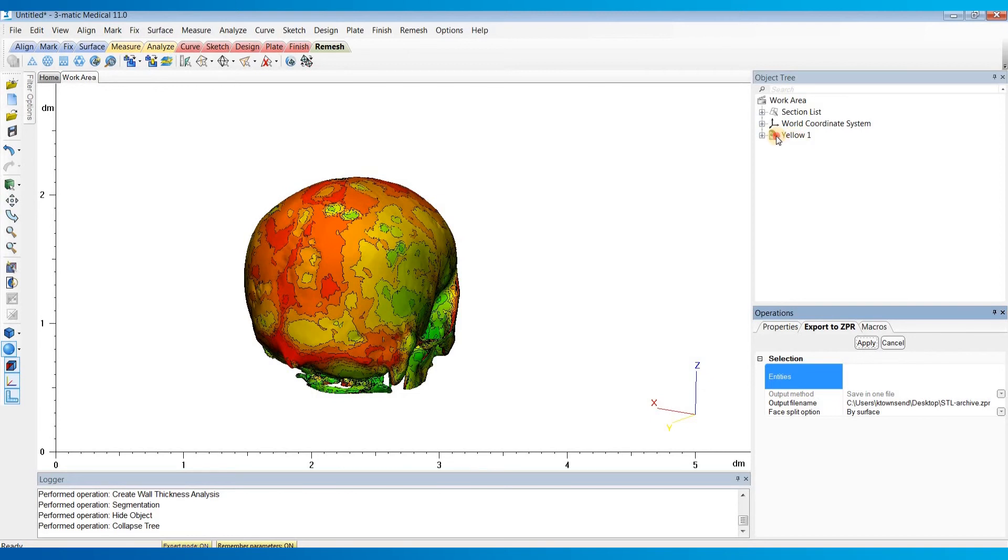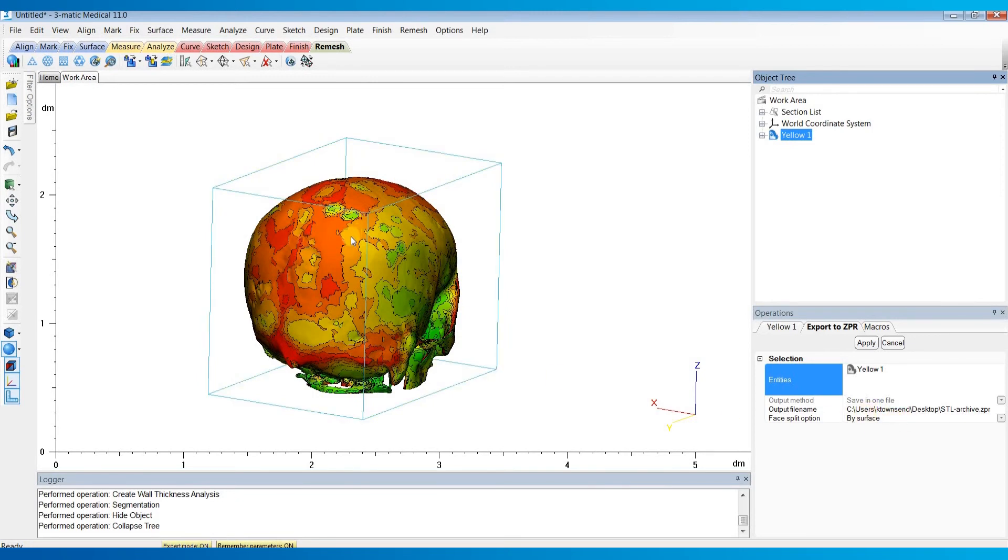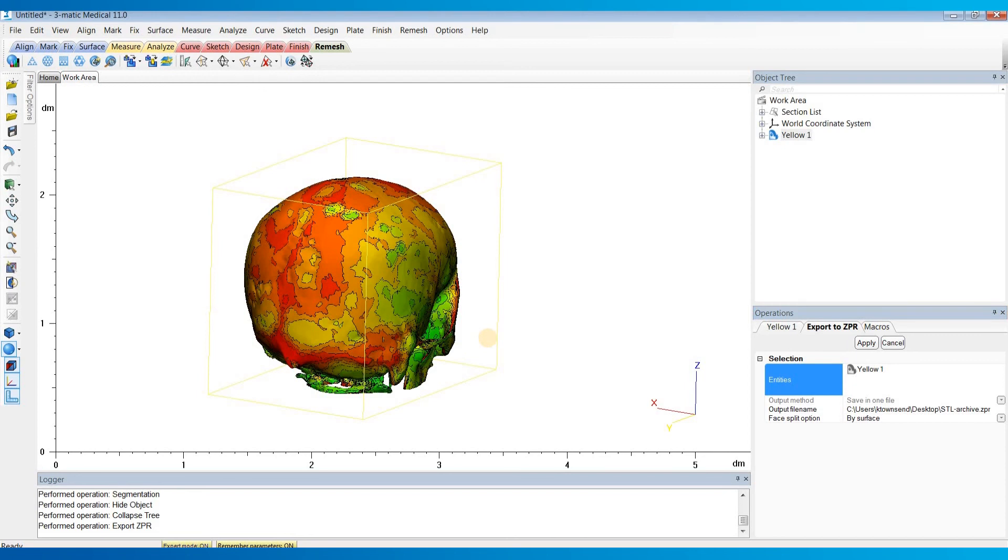Choose the entity that you want to export. Make sure the Face Split option is set to By Surface, so it'll make sure it splits each face according to what surface that triangle is on. And then just hit Apply. And now we have our file exported and ready for printing.